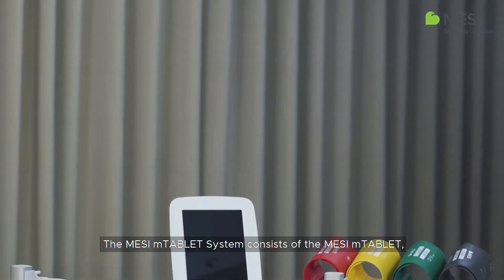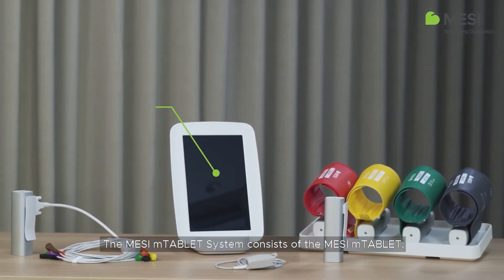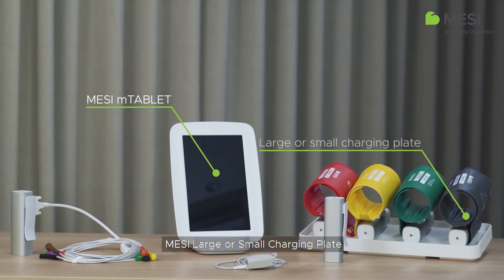The MESI mTABLET system consists of the MESI mTABLET, MESI large or small charging plate, and selected diagnostic module.